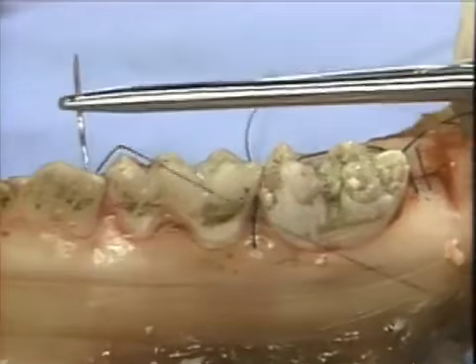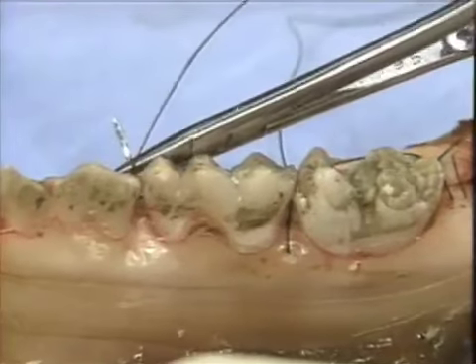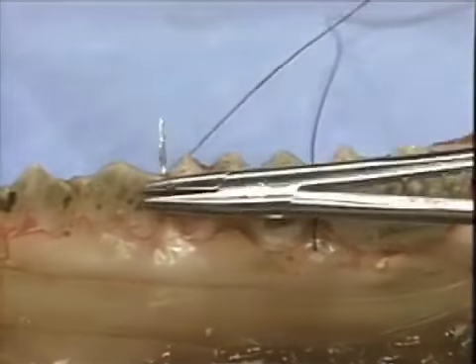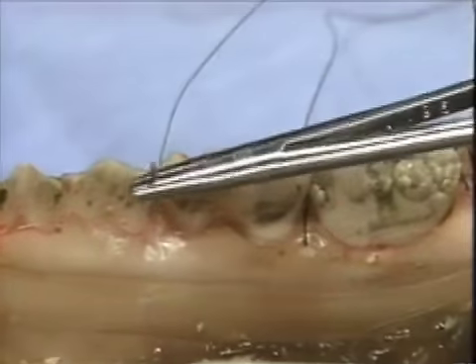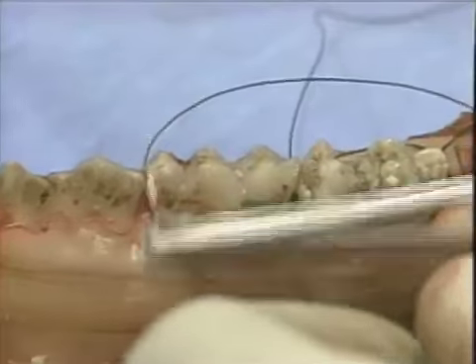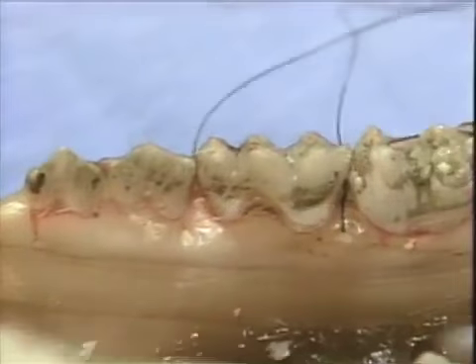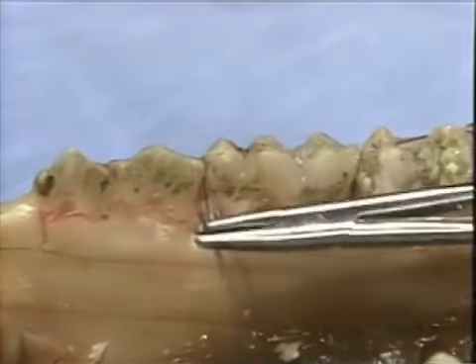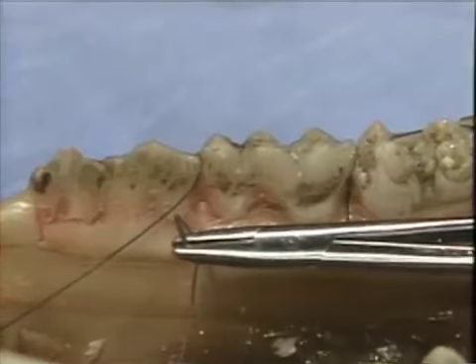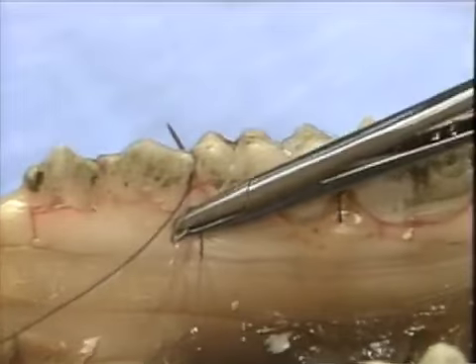As you can see, we will be passing the suture tail first rather than toe first through the interproximal area. This saves time and effort in that the suture can be picked up on the lingual in a position which is close to its desired position for placement into the lingual flap. The suture is positioned below the papilla tip, 3 millimeters or more from the incision line, within keratinized gingival connective tissue.